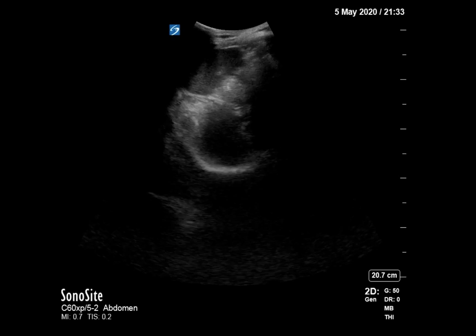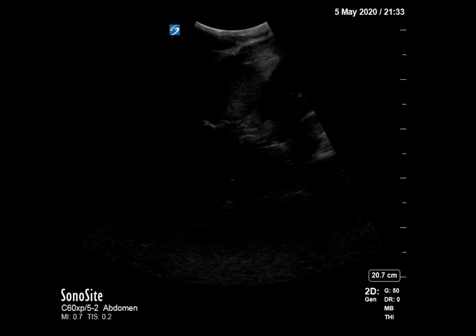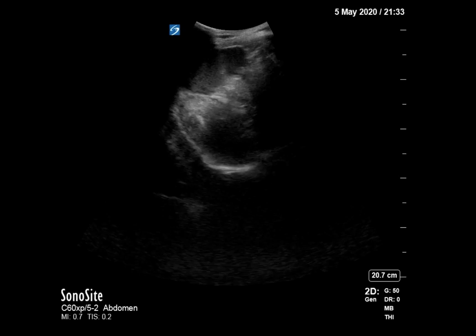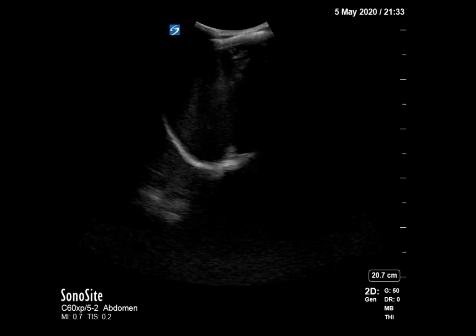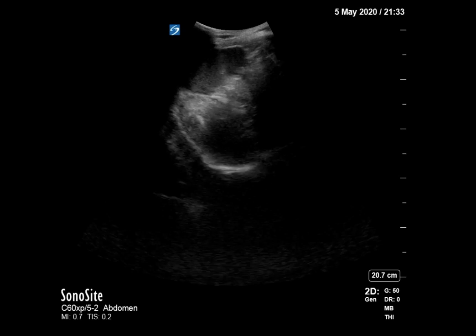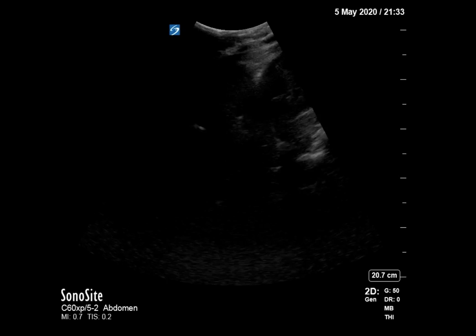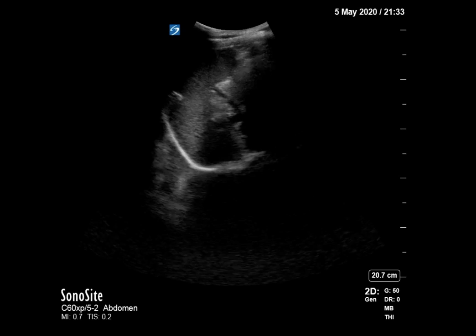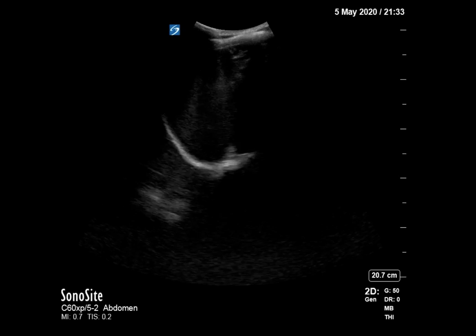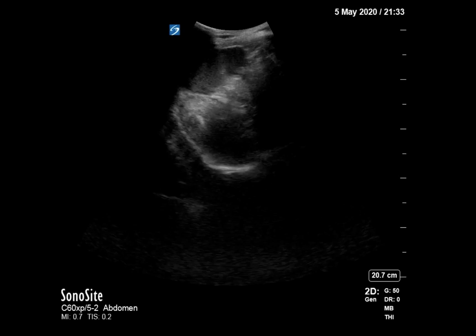This is a FAST exam that was done on May 5th by myself and the internal medicine resident. This patient had fallen approximately 20 feet out of a tree and was complaining of chest pain, right shoulder pain, and back pain. He was placed in a regular ED room and picked up by the internal medicine resident, so we did a FAST exam together. The patient is hemodynamically stable.